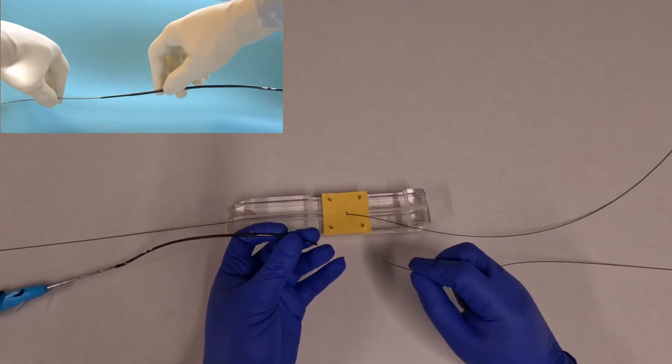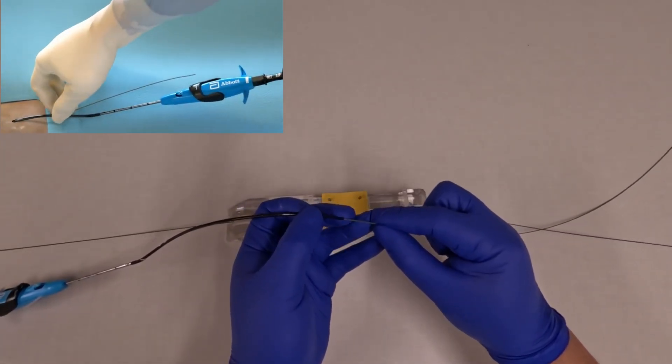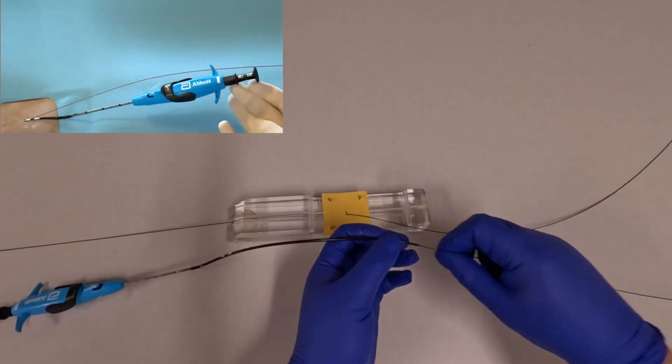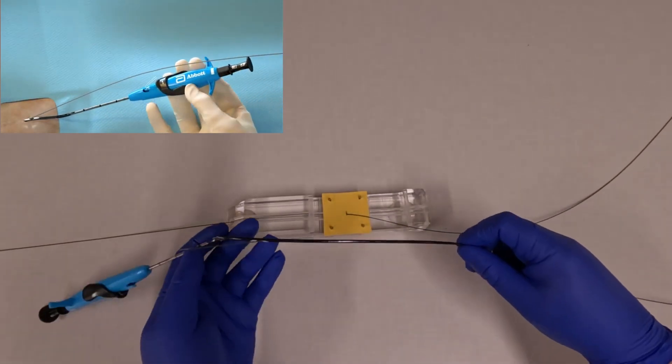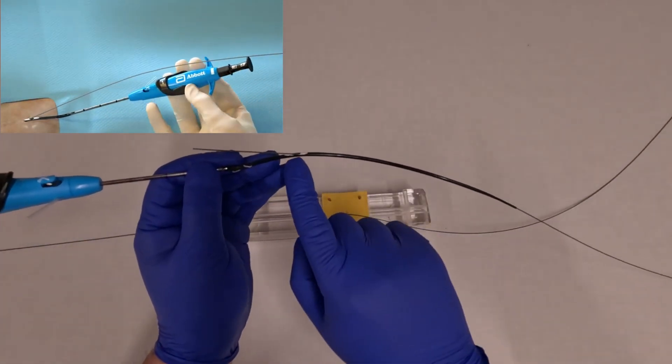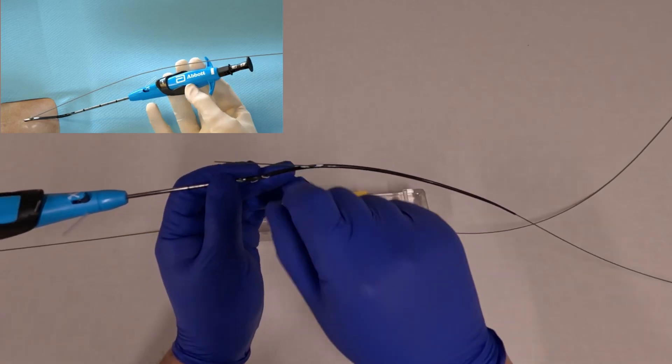The next step is to load the device onto the wire. Remember that you would be maintaining hemostasis either manually or by a second person. The wire will come out of the wire exit port here.